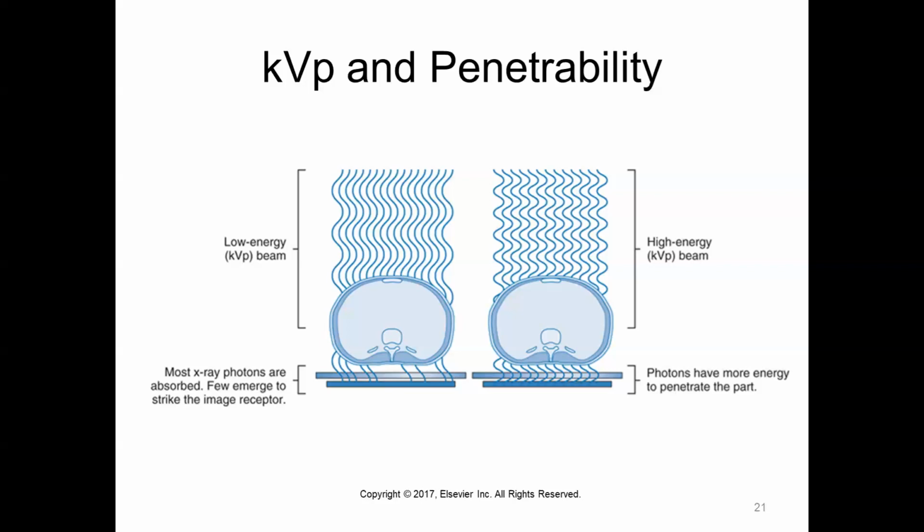You don't want to go overboard with kVp when you want to see bony anatomy. So for extremities, that's another reason why we tend to use less kVp, along with the part thickness. It's just what's going to give us the contrast that the radiologist needs to assess injury.